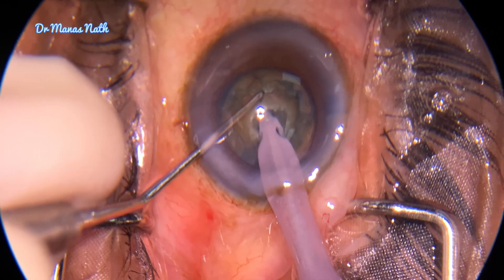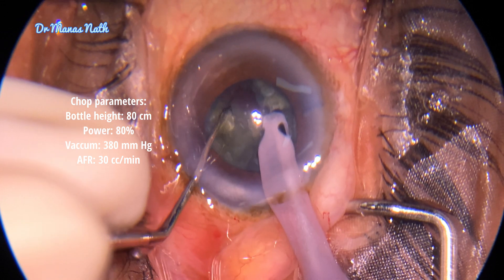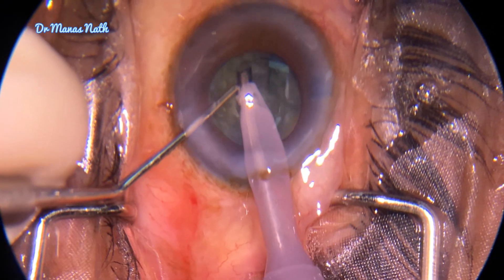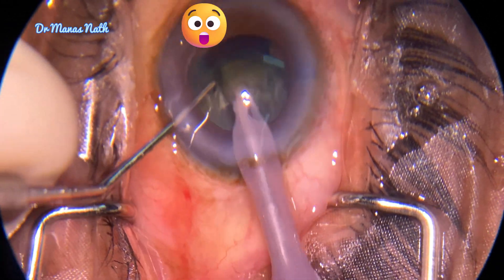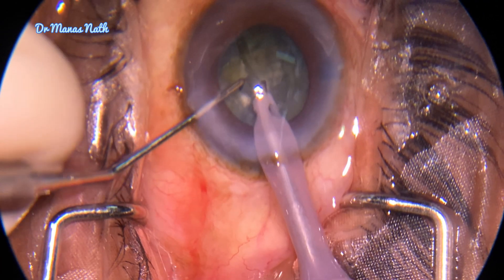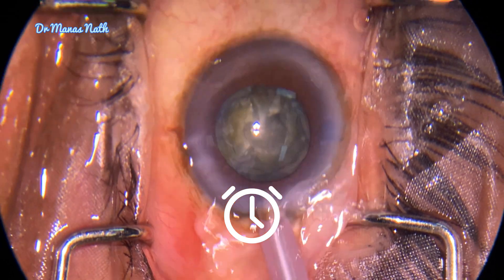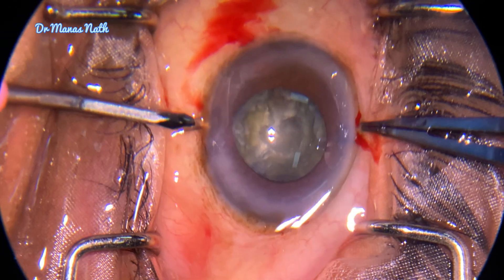I started with the chop — first chop, then second chop — so a pie was created. I thought I would take out one pie to debulk the bag, but to my surprise the whole bag was coming towards the phaco probe. It was quite a scary situation. I decided to give a time out, inject viscoelastics, and dilate the pupil to see what was happening.